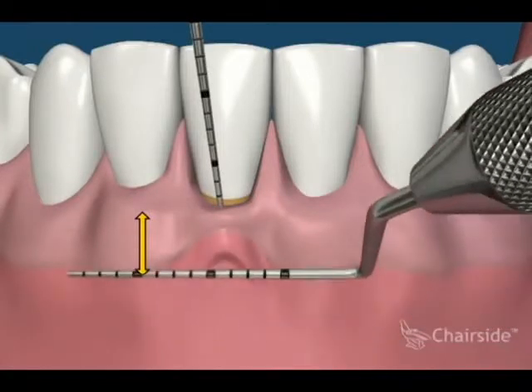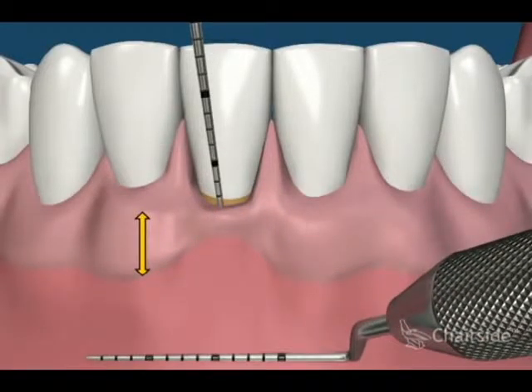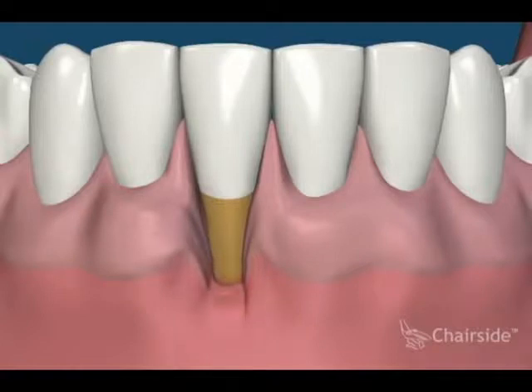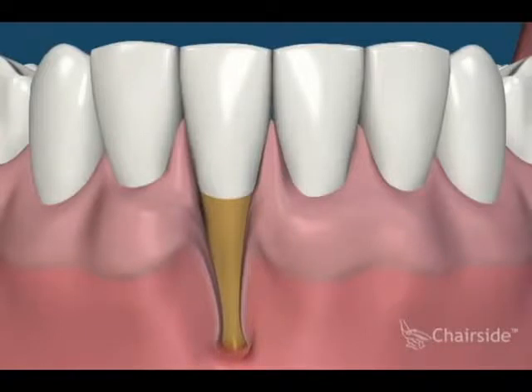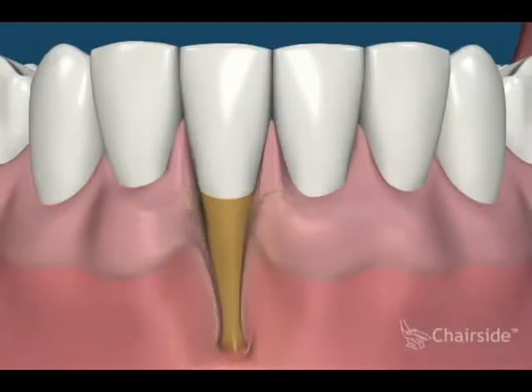periodontal examination. In this case, there is no attached gingiva associated with this lower anterior tooth. The reason it is important to identify these areas is to prevent localized gum and bone recession. There are various periodontal procedures to increase attached gingival tissues and prevent this from happening. If left untreated, this recession and bone loss can progress to such severe levels that a tooth may actually fall out on its own.